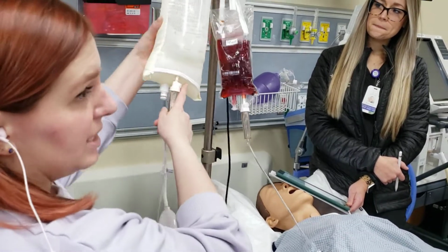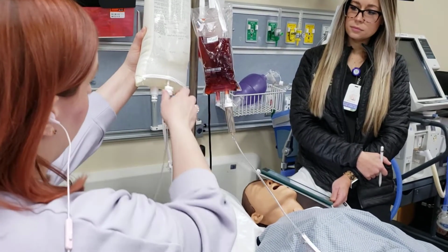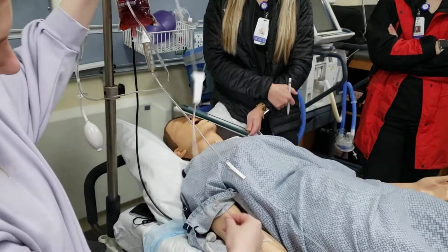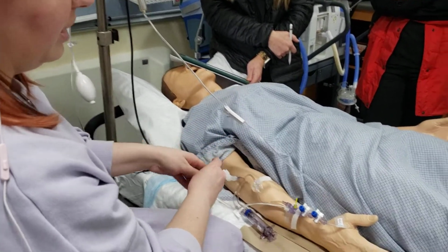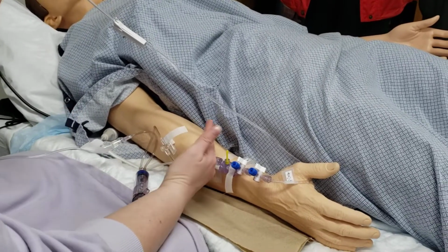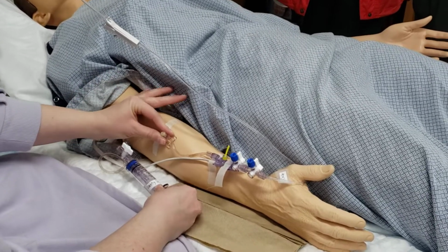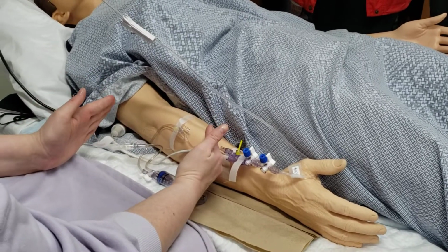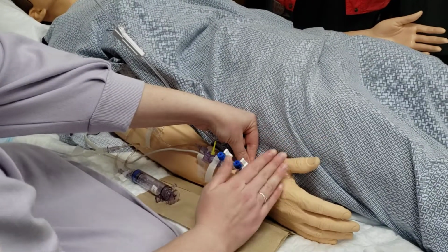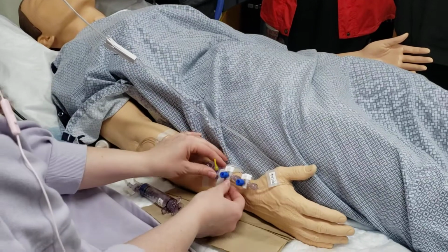We have just normal sterile saline in the bag for our fluid to keep within our line because we don't want any type of bubbles or air. As we continue down, we have fluid down to our sterile line. And again, this is a different setup than a normal patient setup. We have two different sections because I want my students to do different setups. We have the safety set, and then you draw with the safety set, which is right here. And then we have the stopcock setup, the insertion site, which is technically right here, and then our patient. So if we were going to draw from this, and then the transducer.